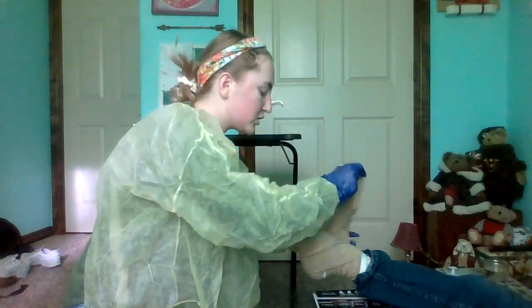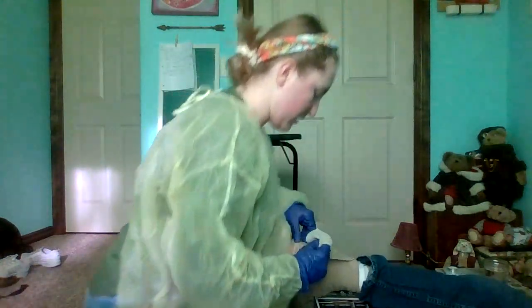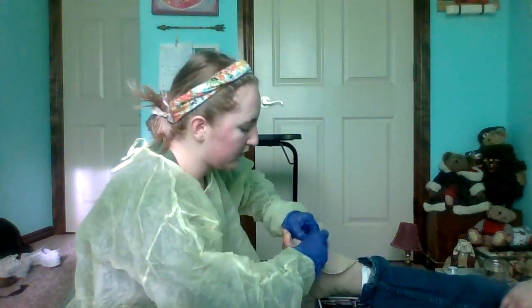You can make sure that you have about 1 to 2 fingers. Let's go ahead and I'll tuck that in there right now. So you can check 1 to 2 fingers, make sure that there's enough room. You can do a blanch test, so that's where you pinch the toe, it turns white, and then you see how long it takes to get back to its color. Make sure they have great circulation. You don't want it to be too bulky, so they can't put their shoe in there.